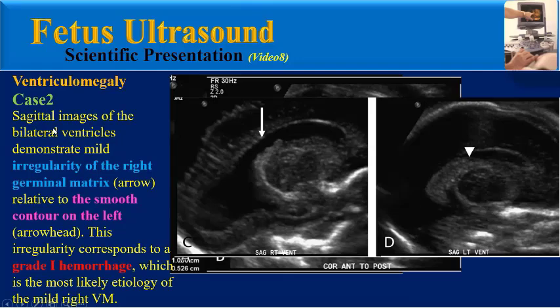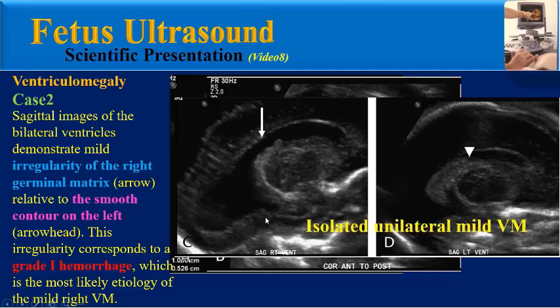A coronal image from the same patient confirms asymmetric dilation of the right ventricle relative to the left, with a normal cavum septum pellucidum visualized in the midline. Sagittal images of the bilateral ventricles demonstrate mild irregularity of the right germinal matrix relative to the smooth contour of the left, corresponding to grade 1 hemorrhage, which is the most likely etiology of the mild right ventriculomegaly.